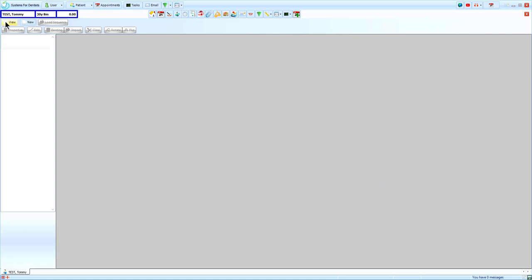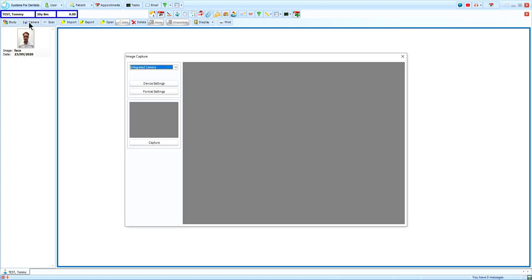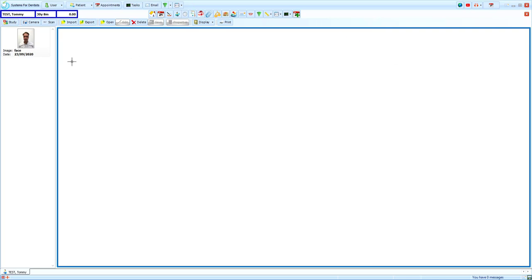By selecting view, we are able to return to the standard image view. Camera links to any camera you have set up on SFD, allowing you to capture images directly into the system.